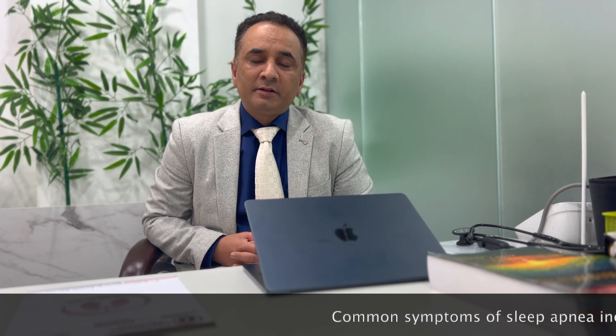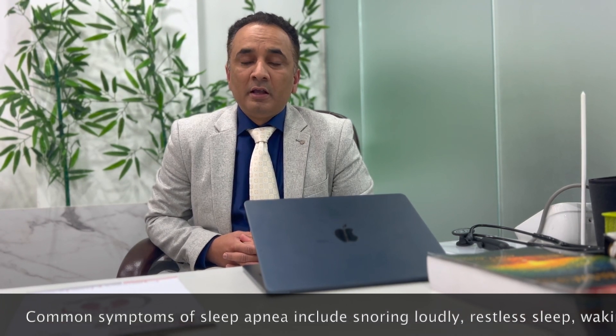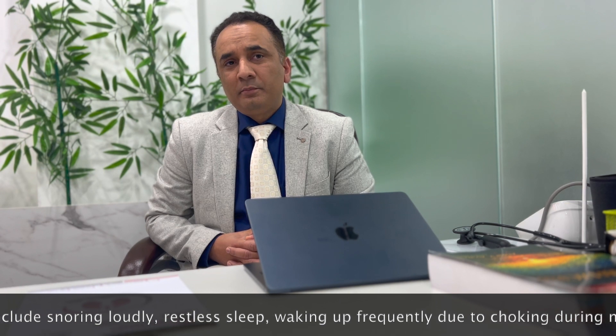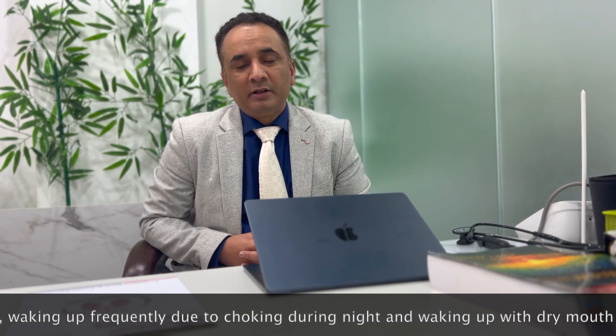The patient also wears a nasal cannula around their nose which senses snoring and measures how frequently they stop breathing during sleep. We also use an oxygen saturation monitor which continuously records oxygen levels and determines how often the oxygen level dips significantly. It also measures variability in heart rate. Along with that, we use ECG leads which measure heart activity — important to pick up any heart abnormality and to assess how much variation occurs in heart rhythm during sleep.